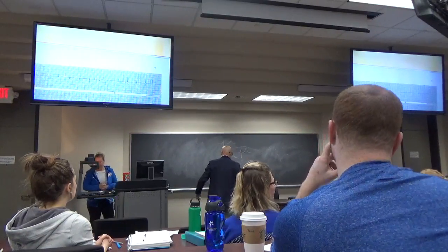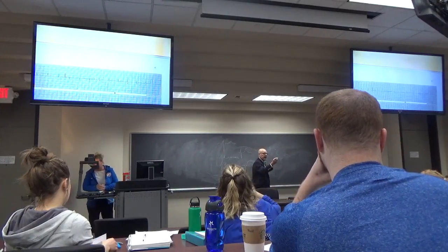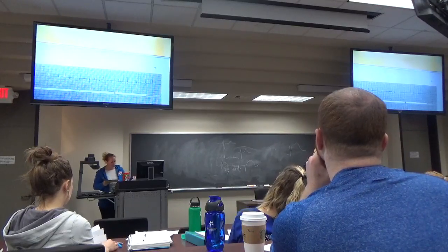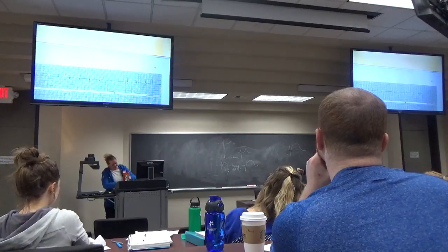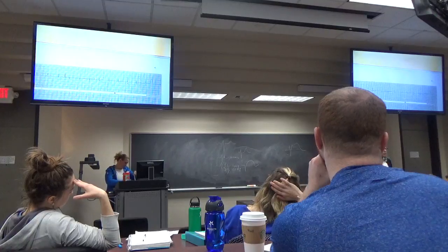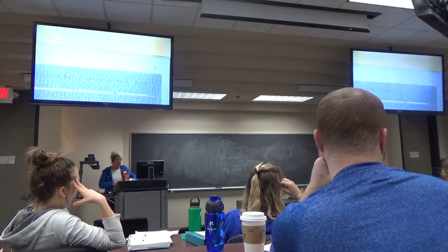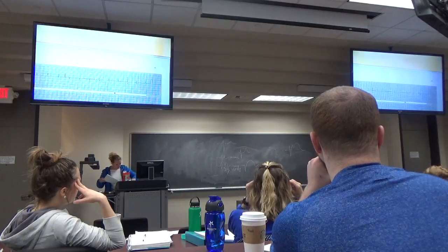Now here's the other thing. This is the other reason that you don't just send them to the cath lab. I've said this before. Here's your baseline. Here's your J point. Aneurysm. This is an ST segment elevation. The patient is lying in your ER saying, I've got horrible chest pain and I've had it since midnight. It's now 8 o'clock in the morning. Horrible chest pain. I've had it since midnight. And you've got this EKG.